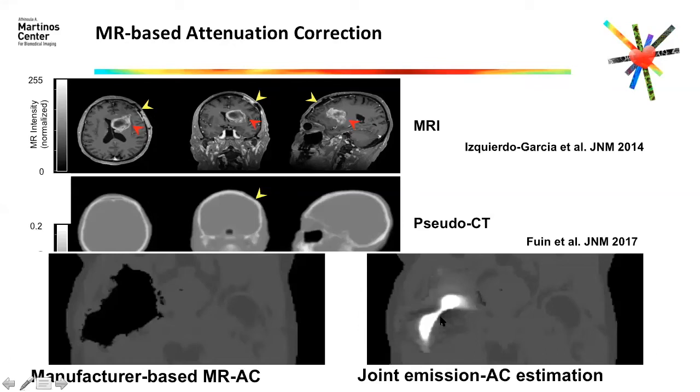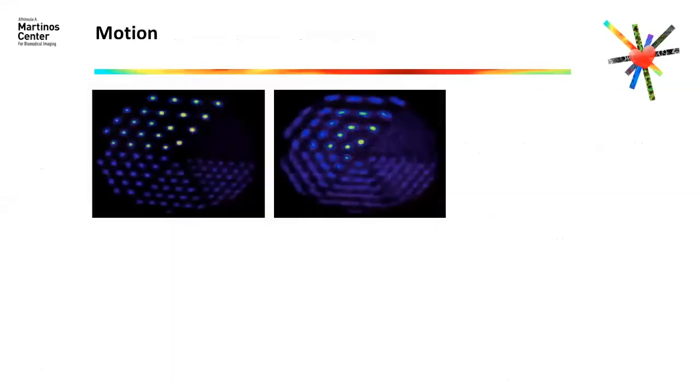And that's important in a lot of the pelvic imaging studies, prostate or ovarian cancer, or GI cancers, a lot of areas around the pelvis with these huge pelvic implants. This will have a huge effect. So another area is motion, and this is very important in many cases.